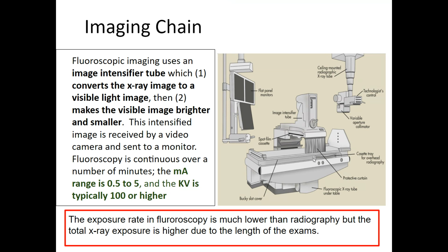We have to move this all the way out of the way, as far down as they'll go, because, and it's happened to me half a dozen times, radiologists will start to fluoro, and they'll see a dark black thing on the monitor. So not only are we exposing the patient, but we're wasting the physician's time, and they're usually not happy about that. And it was all because I didn't move the Bucky tray over. It's like one little thing I forgot to do. So you move it out of the way and lock it in place.